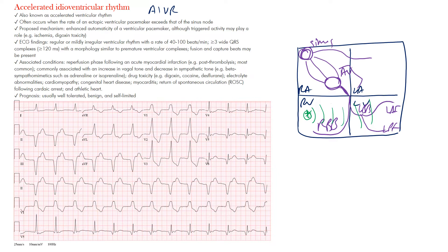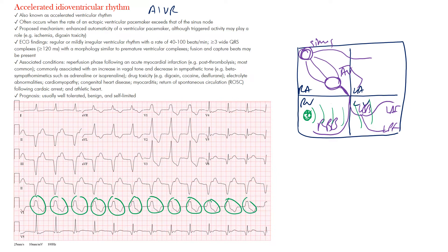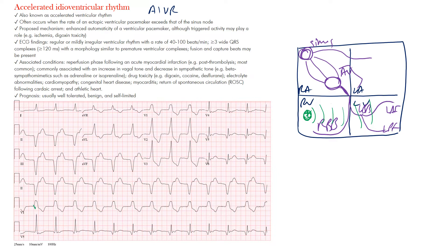If the rhythm is monomorphic, it means it's coming from the same site. Notice the wide complexes down here all look the same — that's monomorphic morphology, meaning it has one appearance. These QRS complexes are wide, meaning they're more than three small boxes, which is 120 milliseconds.